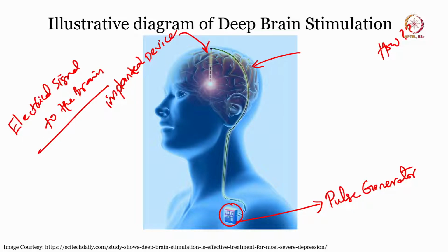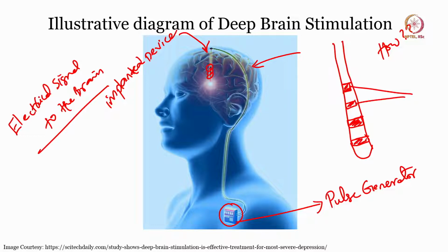Now, you see this, the device structure looks like this. There is some kind of cylindrical shape. I will also tell you why cylindrical and all those things when we discuss further. And there are some kind of dots here, you can see, or rectangular pads, right. So, those rectangular pads are like this. These are nothing but contact pads.